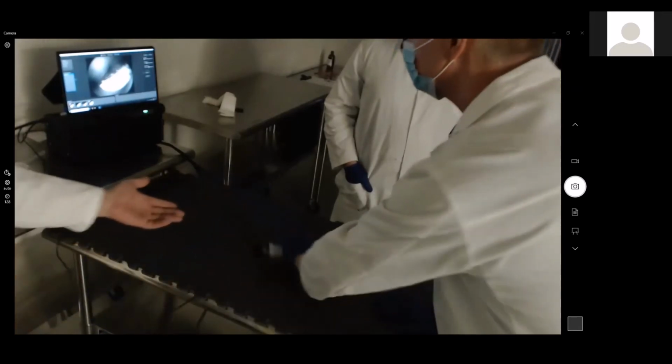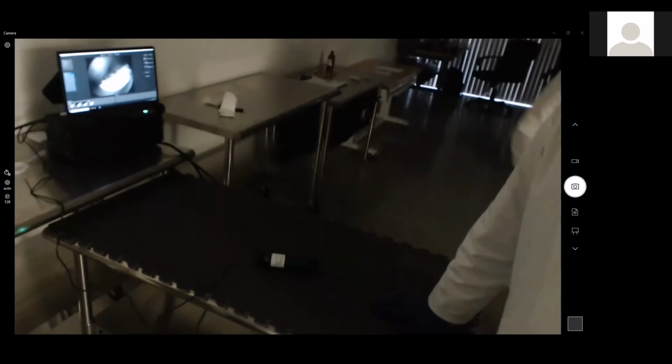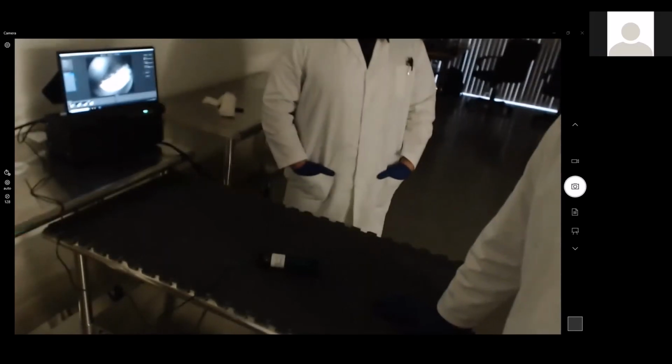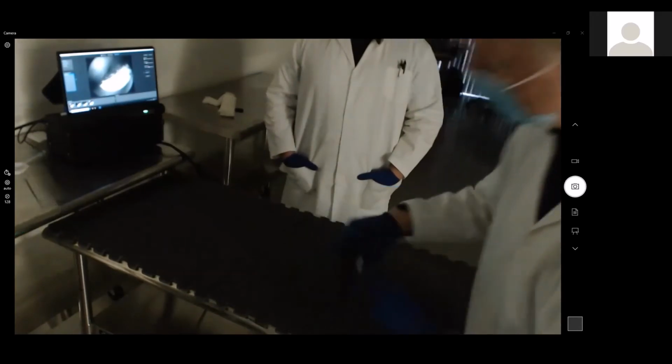I can say we've put this on our eye and looked in our eyes. I know I have in my eye as well, and it's very bright. It's a little hard to get around at first. So I would think in terms of developing a handheld fundoscope, Jill, you chime in here. I would say this thing is currently using.